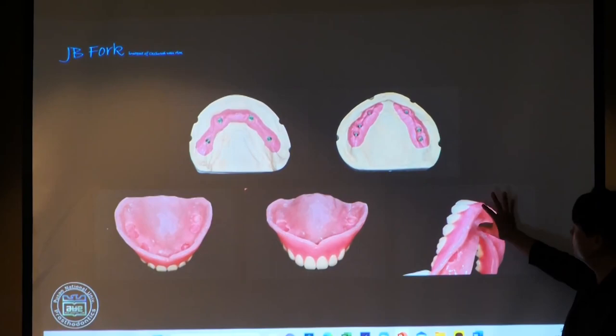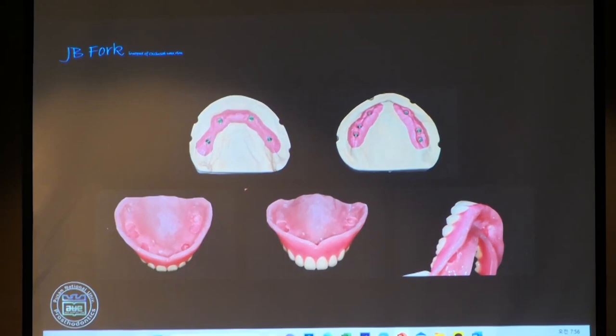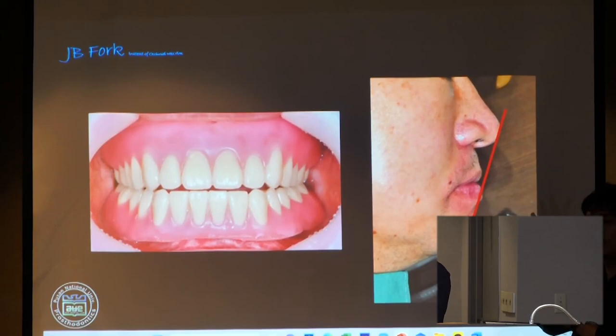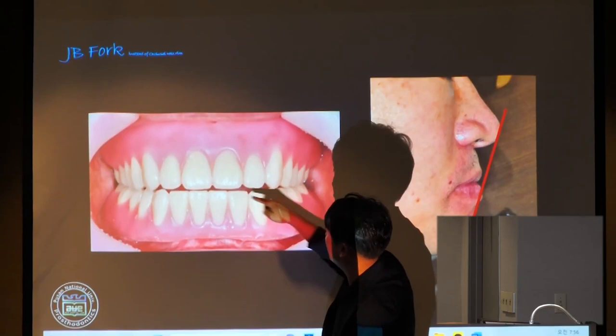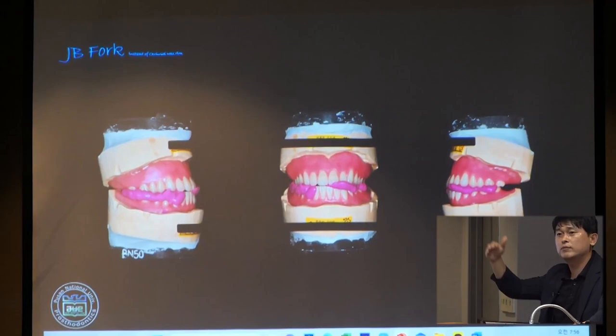There is a very big gap. So dental technicians don't know about that. So dental technicians make only a very short, very inside-positioned occlusal wax rim. So we may need many times to adjust this occlusal wax rim. This patient has a class 3 tendency, so I made an edge to edge bite position like this. I didn't make any adjustment after taking the jaw relation with the JB fork. But the lip support is proper. Although he has a skeletal class 3 tendency, I made the edge to edge bite. I did the reduction, and then bite together. Okay. After adjusting the occlusion, bite one more time and then finish.